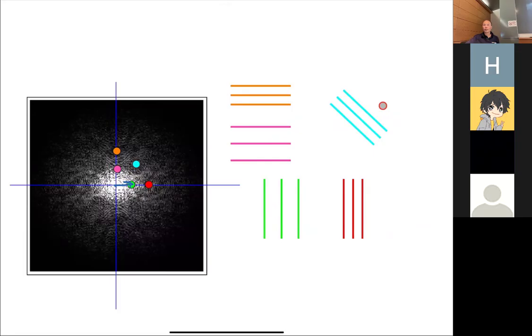Yes, question. So these plane waves, these are like the direction in which that wave would oscillate in K-space? Yeah, that's a good question. These lines I'm drawing are just showing where the peaks of the cosine would be. There's not actually any propagation of the waves in this case, although if you're doing E&M and stuff, then obviously that's the K vector and that's the direction of propagation. Right now, that's just a simplified view.